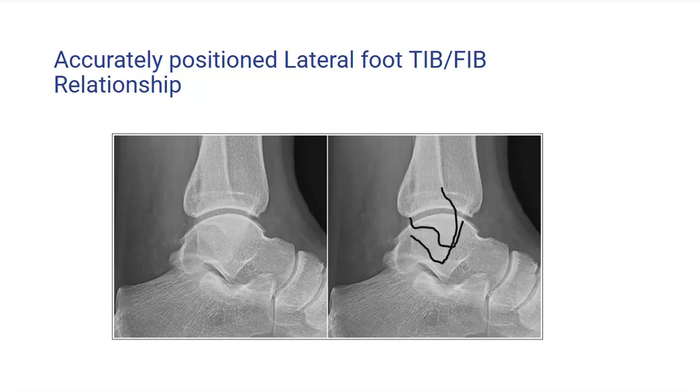For patients who have thick thighs or difficulty extending their knees, you may need to use a sponge to elevate the foot in IR to ensure that the lower leg is parallel to the IR for accurate positioning. This is just an image indicative of an accurate tib-fib relationship. So let's talk about rotation and how to determine it next.